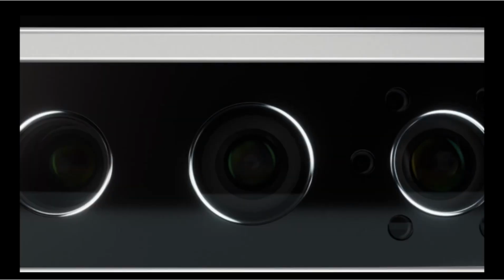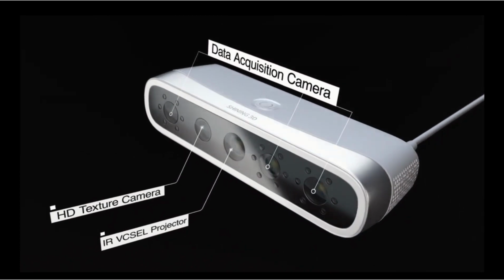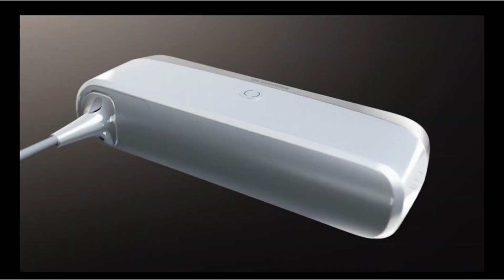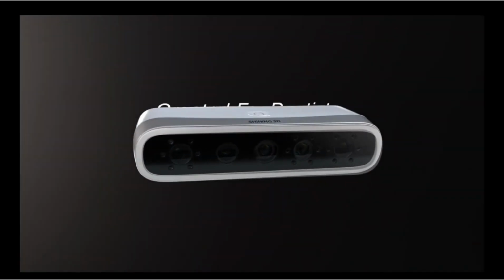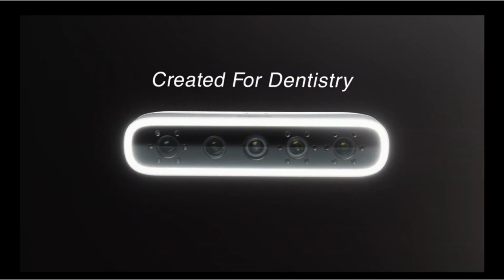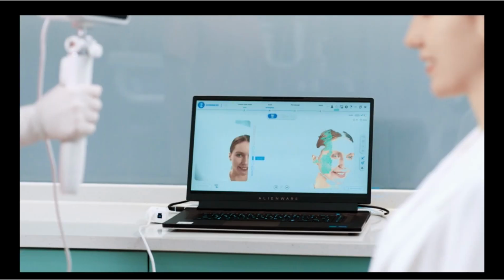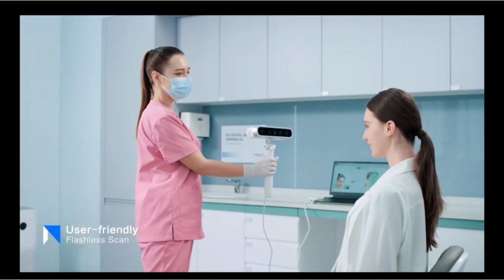Face scanning can accomplish the face bow function in a perfect way by aligning the face scanning to the intraoral scanning. We can easily align the maxillary arch to the horizontal plane, as we see in the video.